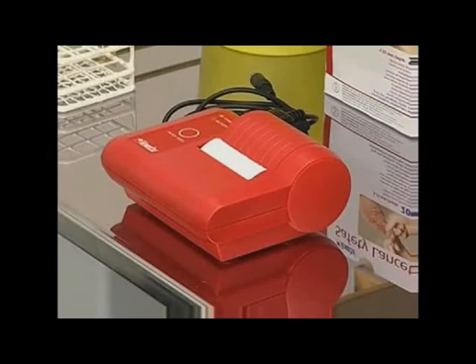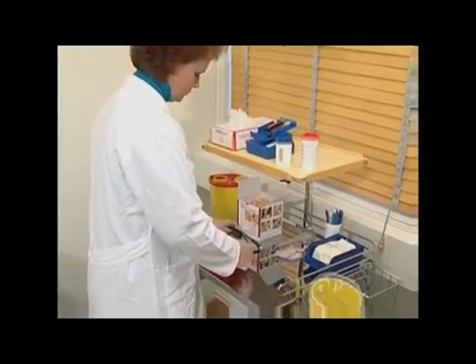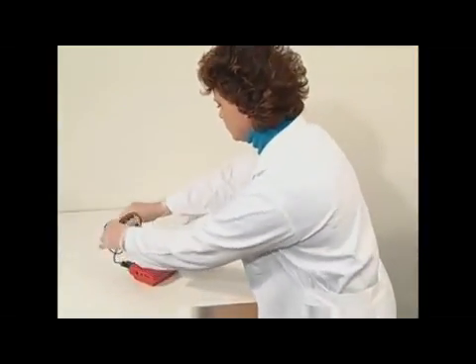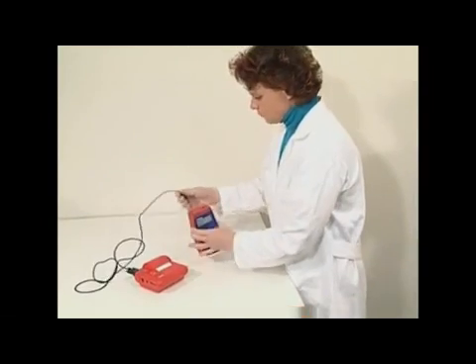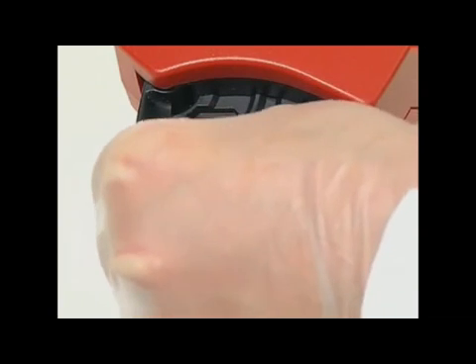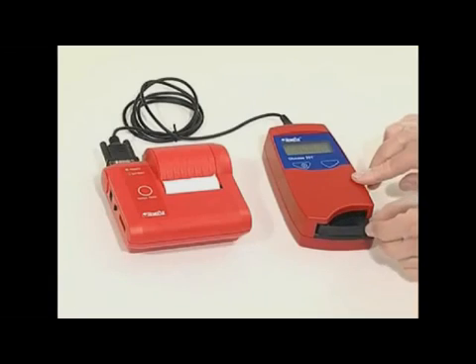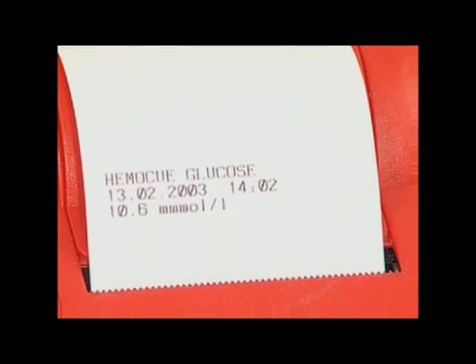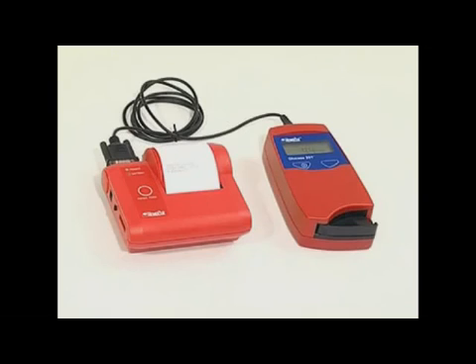The analyzer can be on or off when connected to the printer. Connect the cable to the analyzer and printer, then perform the analysis. When the result is shown on the display, the printer will automatically print the result, date, and time. Only the most recent result can be printed out directly after the measurement.